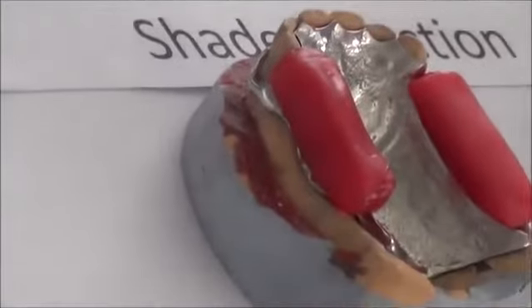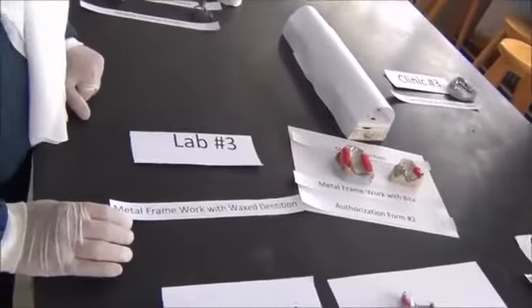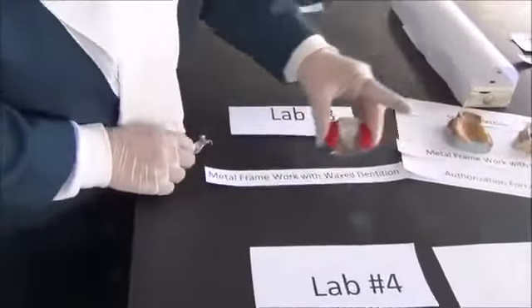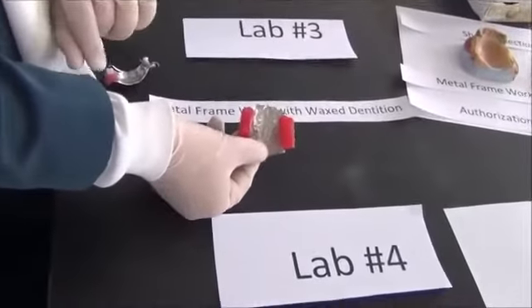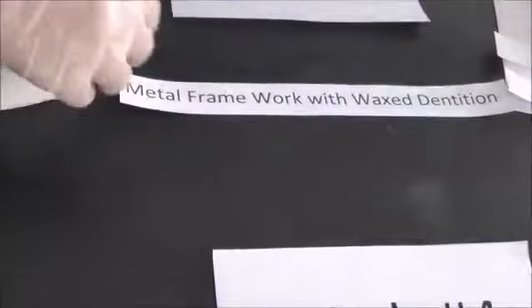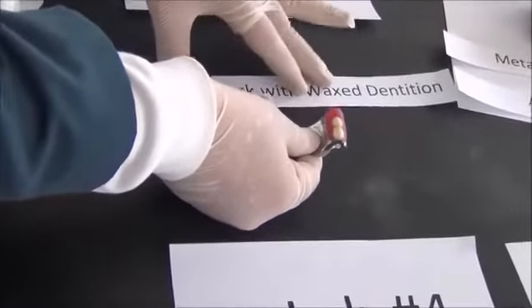We write down the authorization form containing all of the information about the teeth that we would like to choose, their shape, their shade, their size, and this is all sent back to the lab, authorizing them to finish off the acrylic. In lab 3, we will have received these, and the technician will take the metal framework, for example, and using our record will begin placing teeth. Once the teeth are in there, now we call that a metal try-in denture.